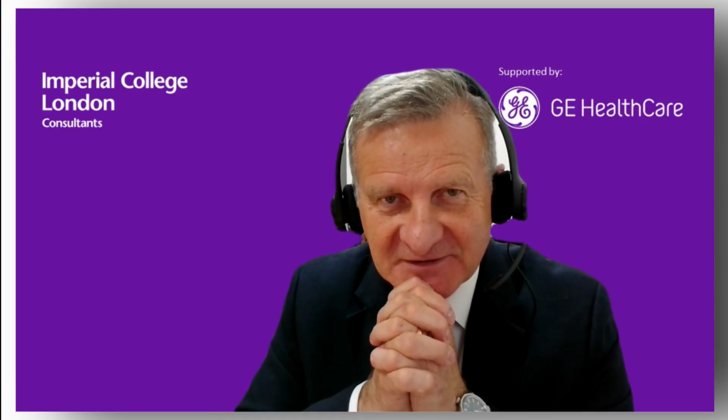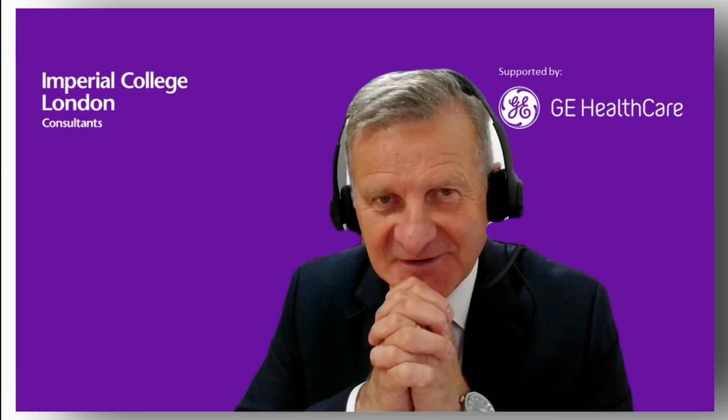Okay, that was a really beautiful demonstration, in fact, one of the clearest demonstrations of STIC I've ever seen. So thank you so much for that, Roland. I think that Laura, what are your views on STIC? Do you use STIC? Have you been using STIC?